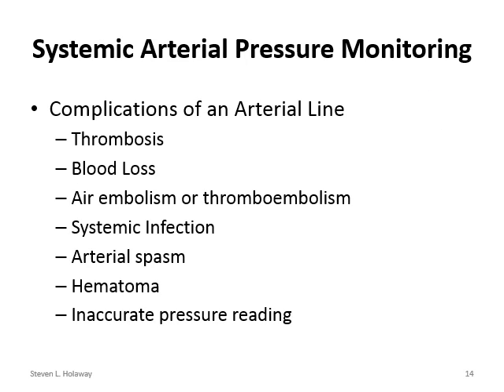Now, A-lines are wonderful. They give us a good reading on the blood pressure, give us a great port to draw blood from, and really help us manage medications and many different things for the patients.